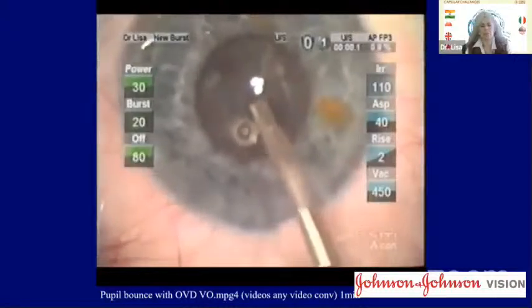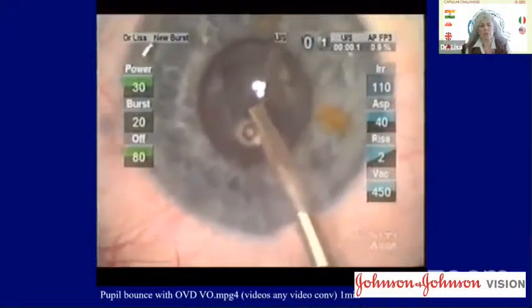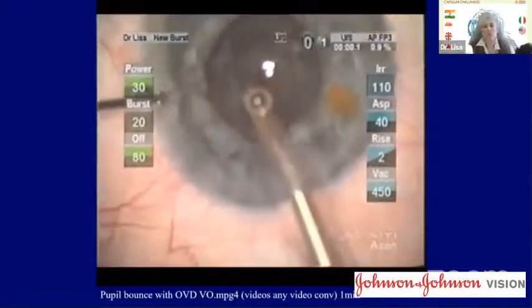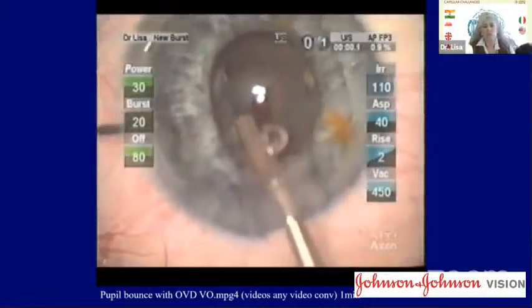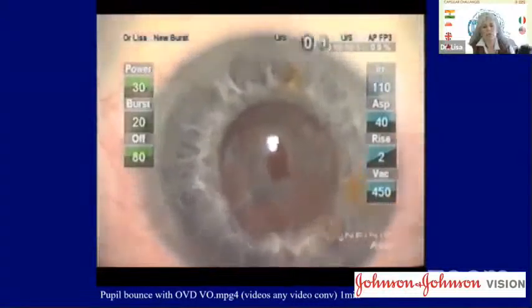You'll begin to see my adrenaline surge as I replace the chopper for a dispersive viscoelastic cannula and fill the anterior chamber with viscoelastic while holding my ground with the phaco tip in place to prevent lowering the pressure and losing the chamber. Only now, when we control the chamber, can we come out, inspect, relax, and plan.